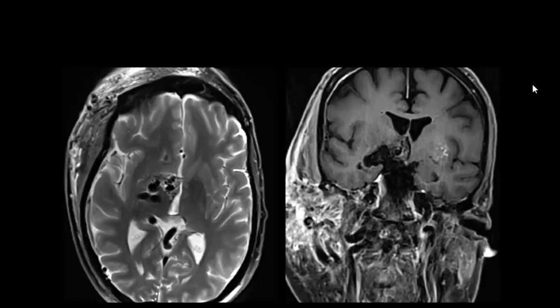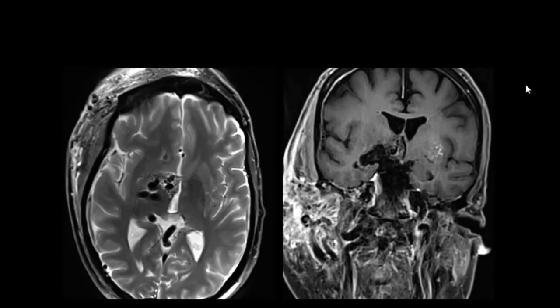Okay, Dr. Sana, can I stop you here and ask you a few things? You are provided with two sets of images, right? One is T2 weighted axial and the other is coronal post contrast T1 weighted. You said that you localized this lesion in the white matter.